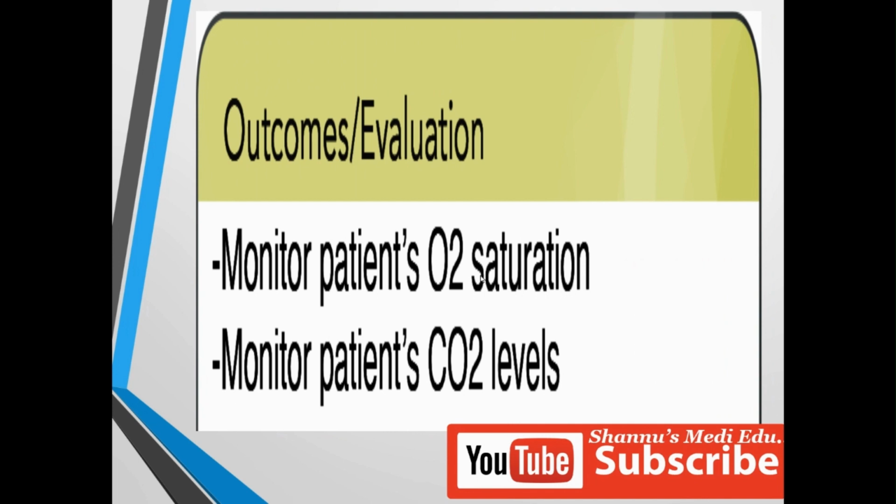If at 3 liters the patient is maintaining, then we decrease to 2 liters, so the patient's lungs will not be affected more.